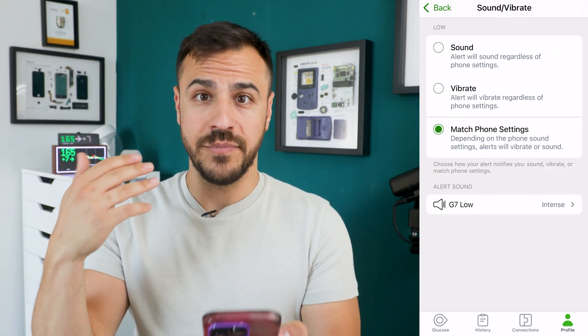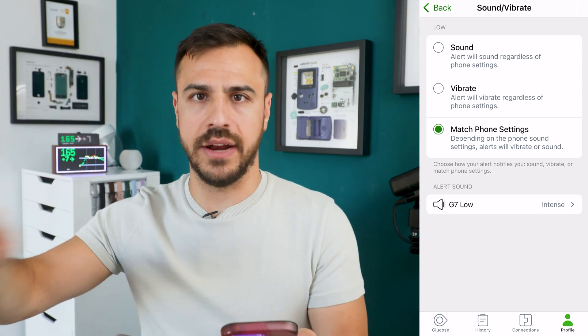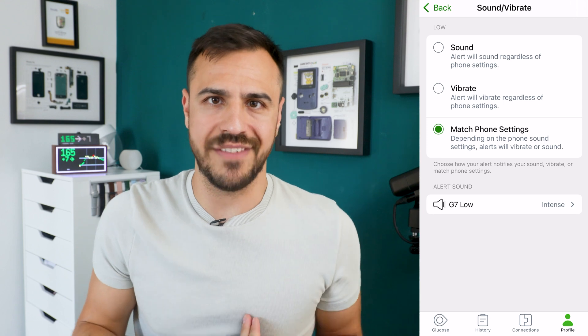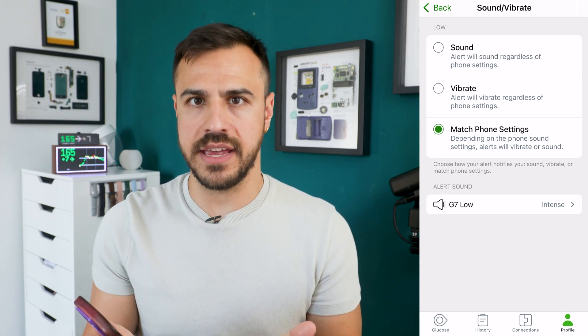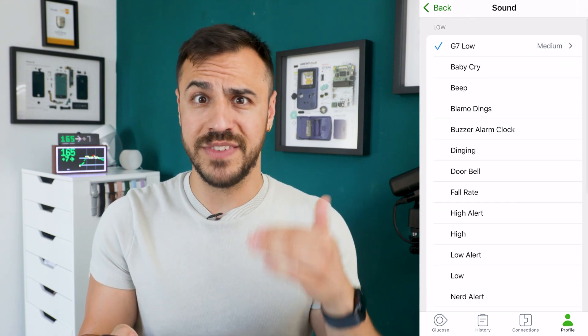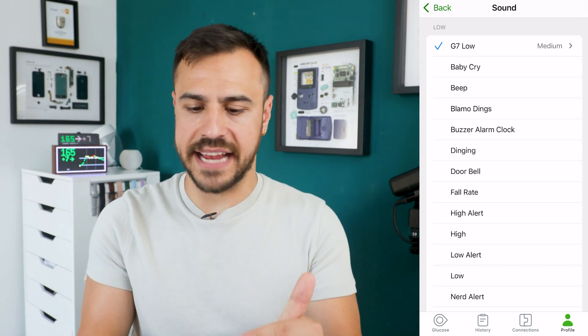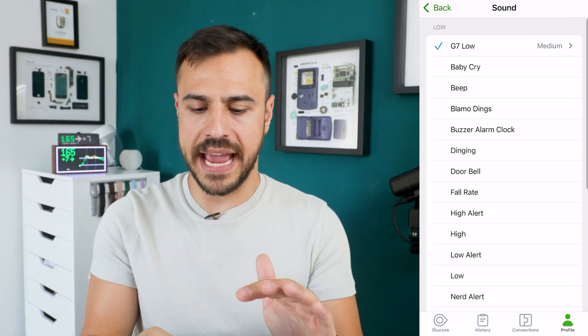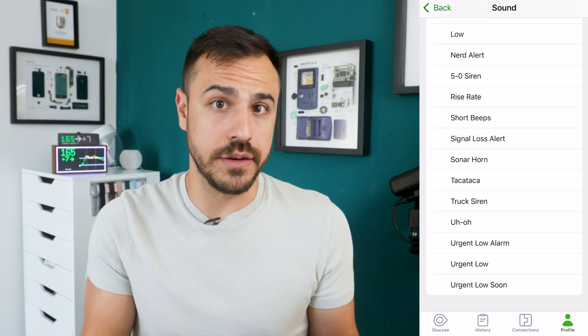You can also change the audio — you can have it always sound, always vibrate, or based on phone settings. I have it based on phone settings. What I like about the G7 over some other CGMs is the amount of sounds you can choose from. There's a whole list — I currently have it set to the G7 low medium sound, but there's a long list of alerts you can play around with.